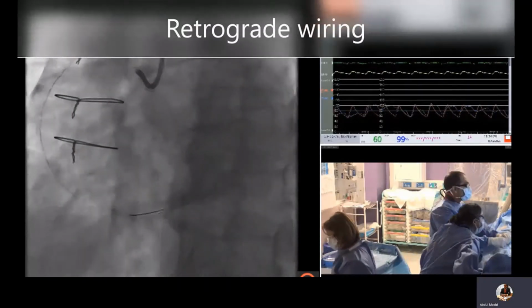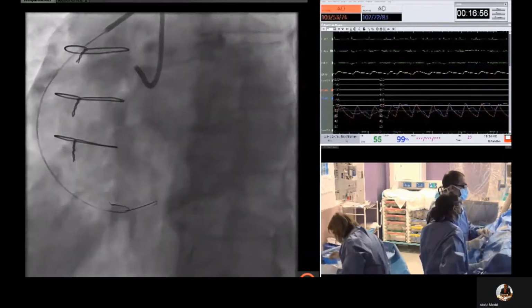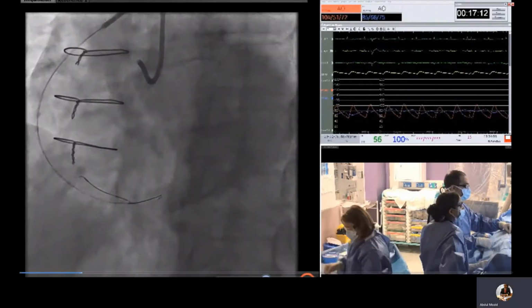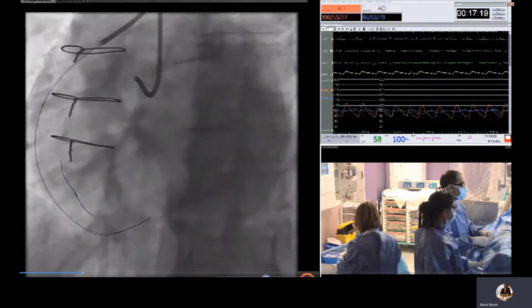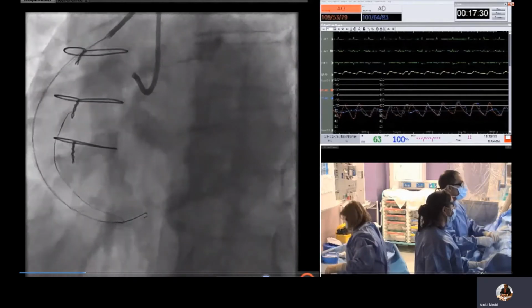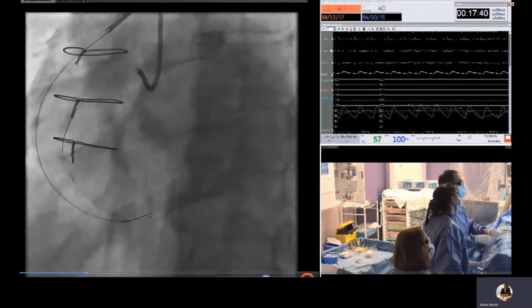The Miracle 12 was then removed and I performed retrograde wiring with a Pilot 200 wire. This crosses the tight stenosis from the PDA to the RCA. It isn't possible to advance the Mamba Flex catheter. The Pilot 200 is then crossed through the occlusion, and the Mamba Flex advances easily. The Mamba catheters are very torqueable and have a tapered coil and integrated tip design, which optimizes flexibility and crossing profile.